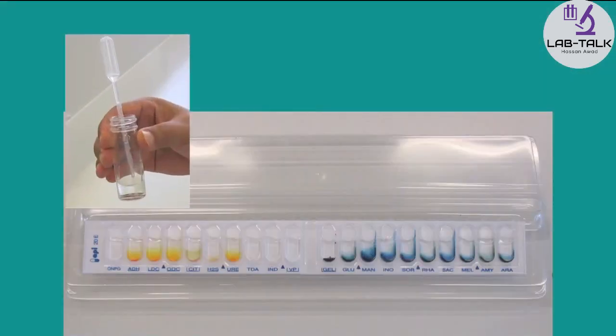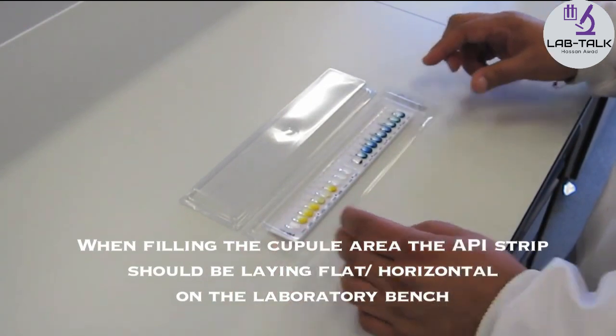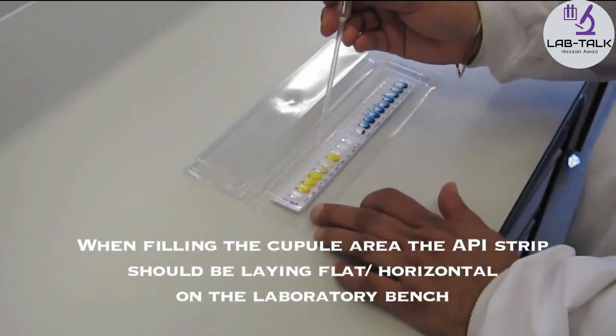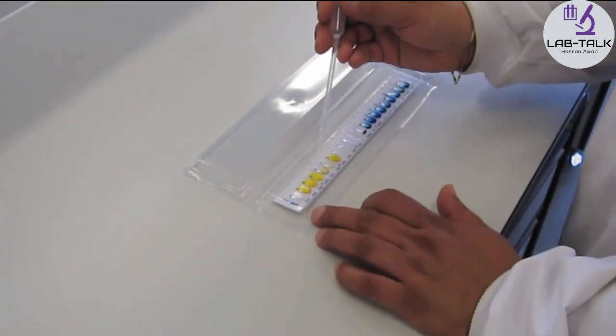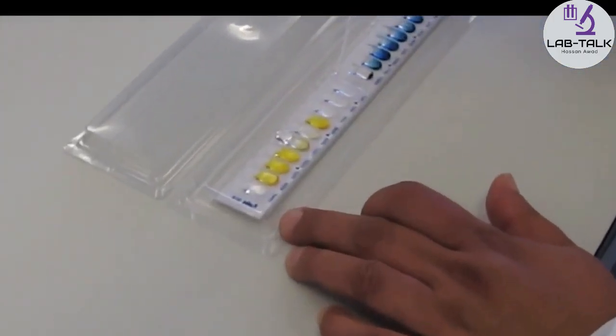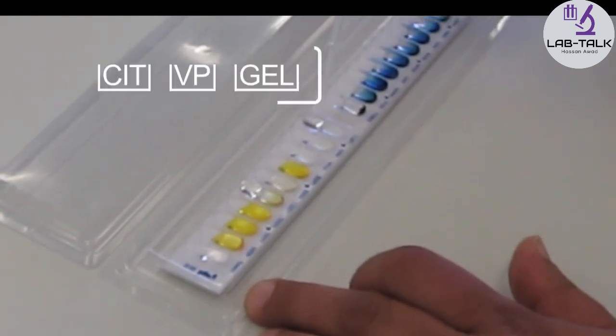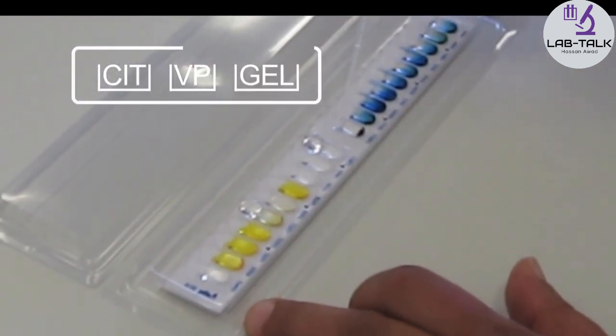Some of the tubes need to be filled with the bacterial suspension right to the very top, including the cupule area. These tubes are marked in the box underneath the name CITVPGEL.